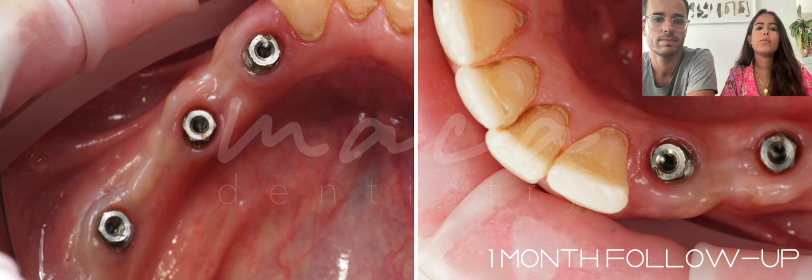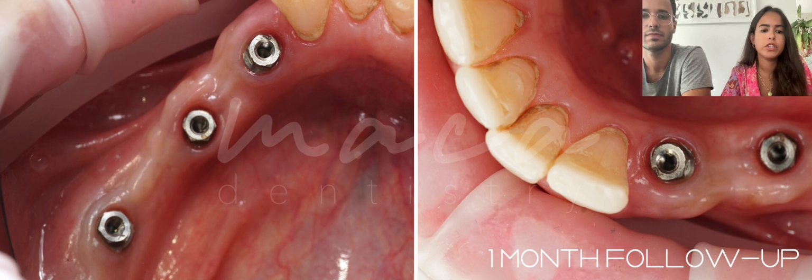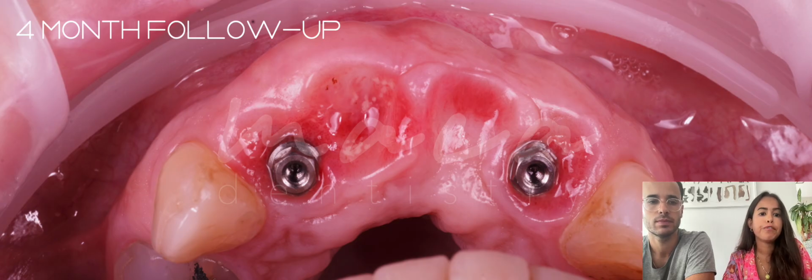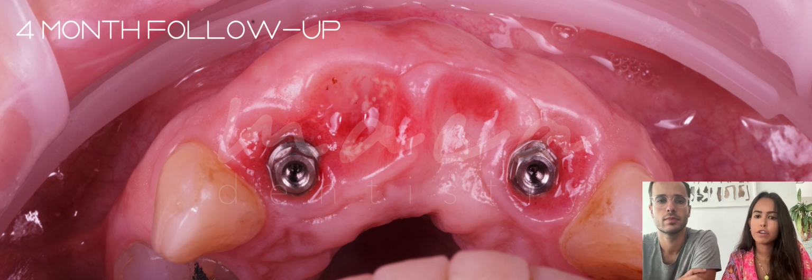Okay, so then 1 month after this second stage surgery, this is how our tissues are looking. So we can appreciate how the graft healed very well around our OMNI abutments, and also how these narrower prosthetic components allow to preserve a greater amount of soft tissue. This is a 4-month follow-up of the upper anterior arch, and here as well we can observe a great healing of the soft tissue around our implants and OMNI abutments.